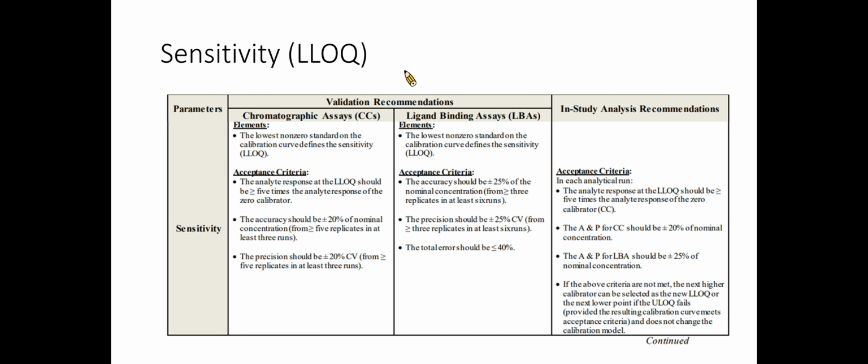The LLOQ defines the method sensitivity and should be determined during method development. The method should be developed and validated such that it will be able to meet the requirements necessary for the intended study samples. The LLOQ evaluations can be done separately or as part of the precision and accuracy assessment for the calibration range. The specific recommendations to validate sensitivity are listed in this table.